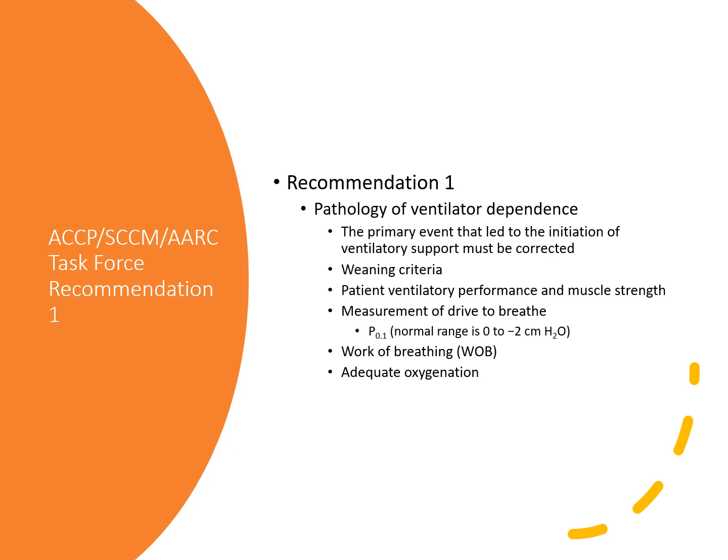So the big thing is looking at measurable criteria for predicting success on mechanical ventilation weans. There are a lot of physiological parameters that can be helpful in adults, but there's no single measure that has uniformly been shown to be successful in predicting a patient's ability to be weaned and have an uncomplicated extubation. It just doesn't exist right now, right? And if you come up with it, I would love to say that I knew you. Let me know, right? Don't deny that you ever knew me if you come up with such an equation or a way to do that.